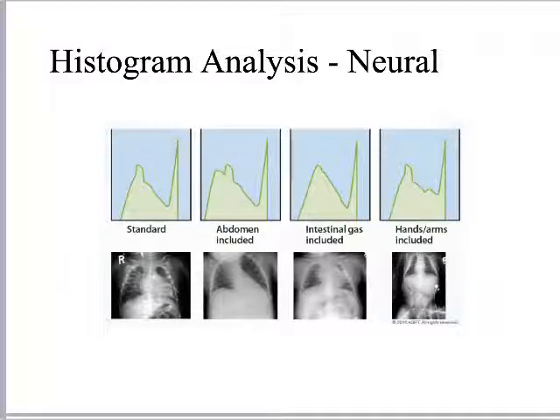So an example of that would be in this department, they're shooting chest x-rays of babies, right? And like we typically do in the NICU, we include the abdomen on the image, right? Now we all know those babies are really difficult to take pictures of. They're squirmy. It's hard to make sure that we're not contaminating the field. There's a lot of factors there. Some of them are smaller. You might have shot the baby yesterday and they've gained weight in the following days. So things are changing on a day-to-day level with the child, right?